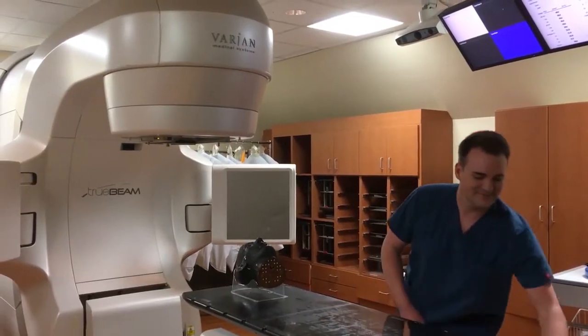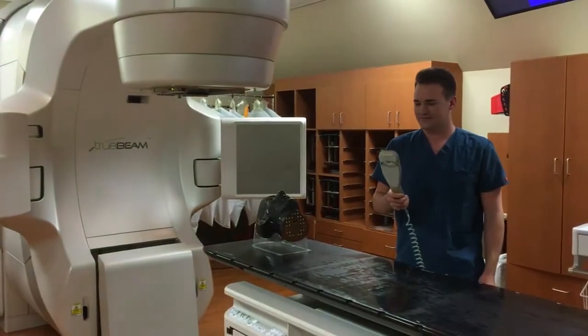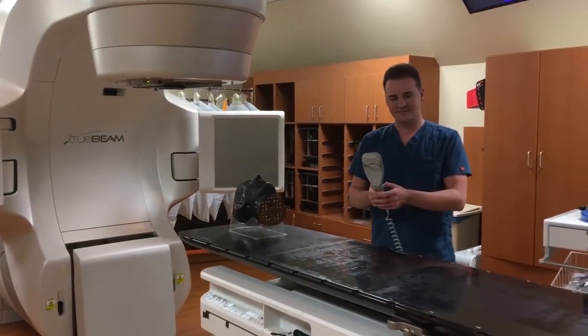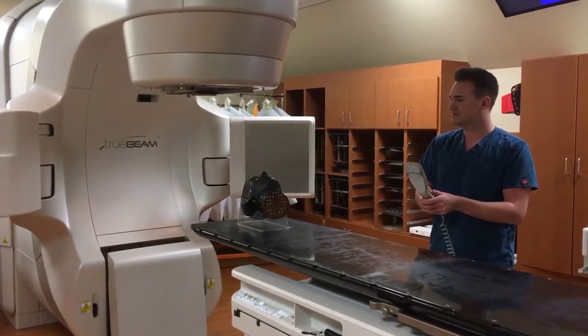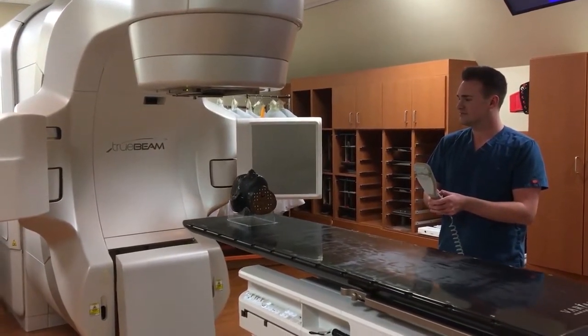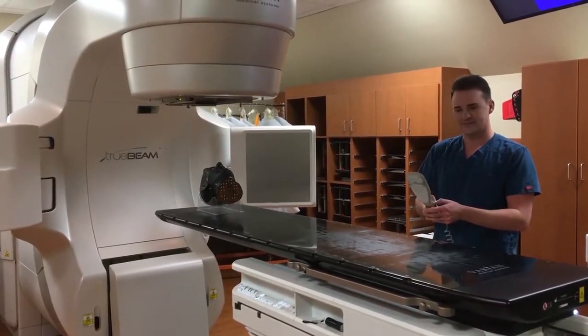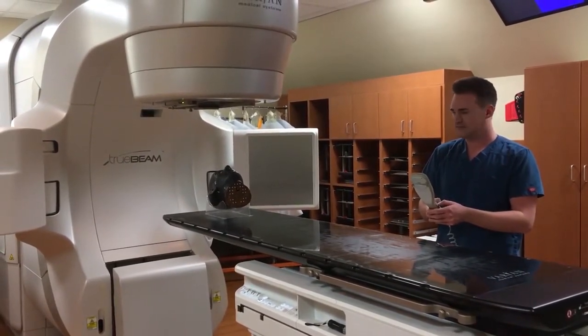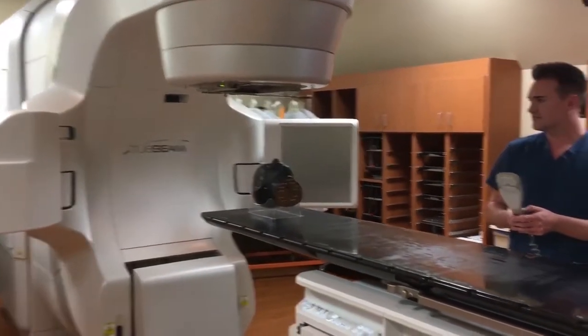In order to get the patient set up in their treatment position within the linear accelerator, they're positioned on the table, and then the table is moved in various directions. The table can move up and down. It can move longitudinally, or closer into or away from the gantry. It can move left and right, or laterally, and can even rotate if need be.